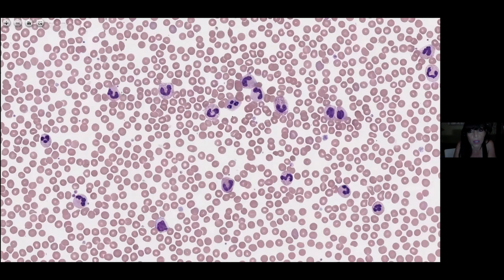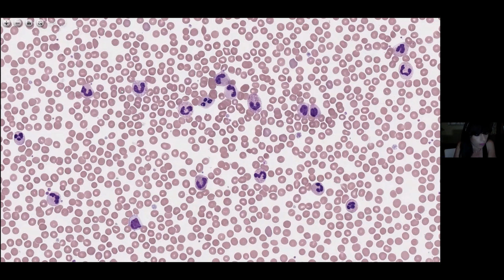Yeah, I agree. I've got an interesting table that I can share with you, and we can compare all the different diagnoses that are possible for morphological features like this, as well as the ones that we've seen previously. Let me share my screen.